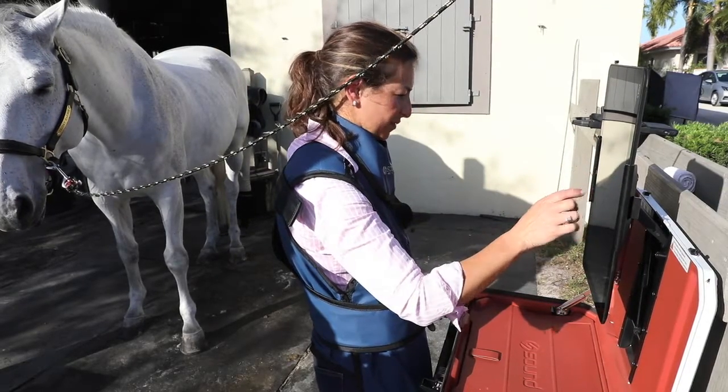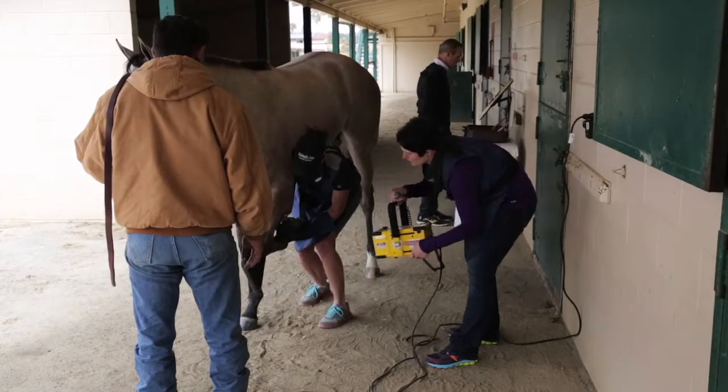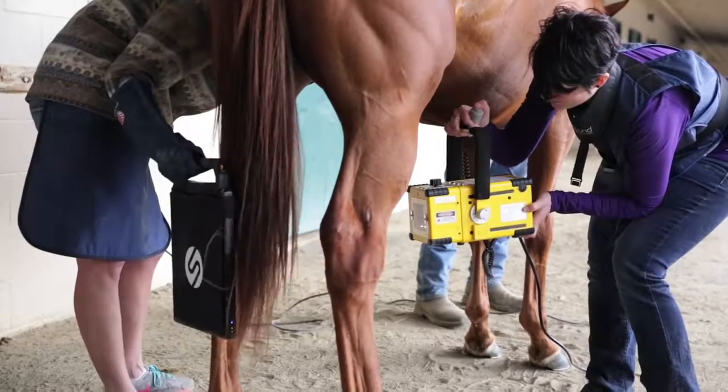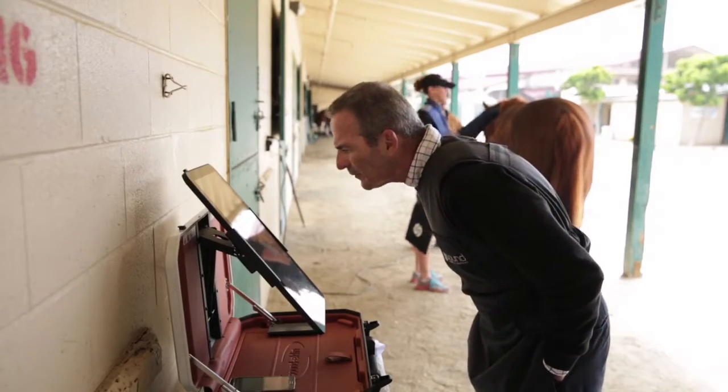You sedate the horse, you get everything ready, and my clients are always really impressed with how good the images look. Actually, it's kind of frustrating to read when I'm reading in the repository different brands of radiography equipment. Because we're so pleased with the image quality that we're getting now that we feel a little spoiled — it's difficult to read other images. But aside from the image quality, there are so many other things that have really made me very enthusiastic about using the Next product.